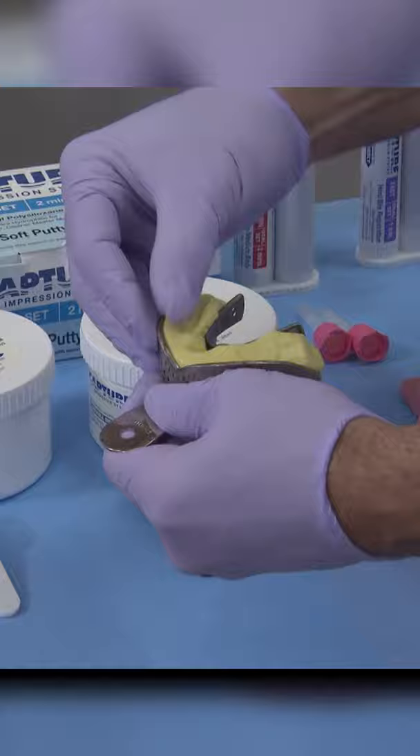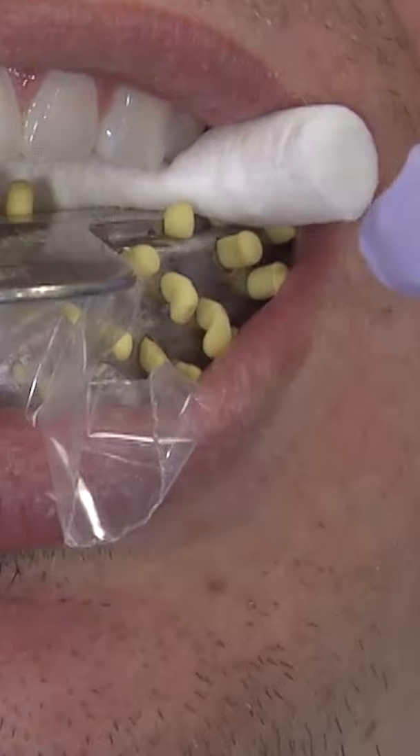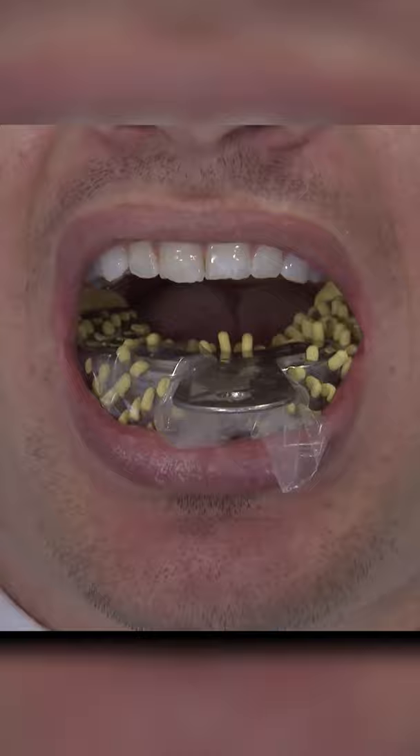Roll the putty into a cylindrical shape and place into your pre-sized tray. Shape the material and then place the pre-cut plastic square over it. If done properly, you should see the excess material squeeze through the locking holes built into the tray as shown here.